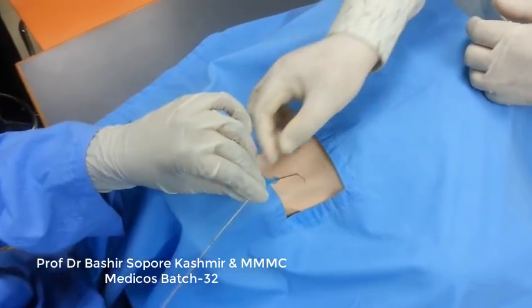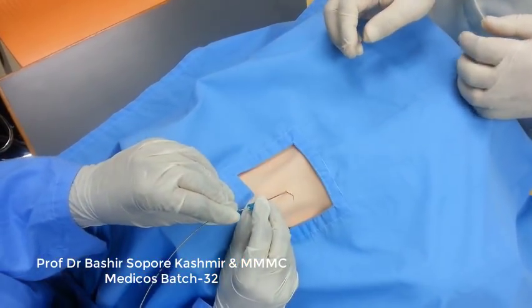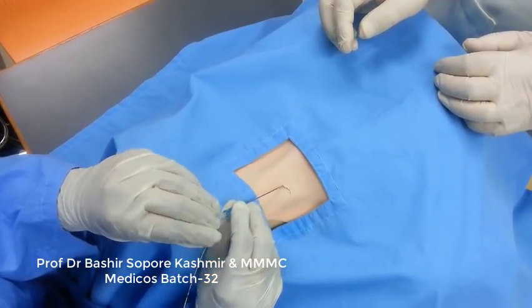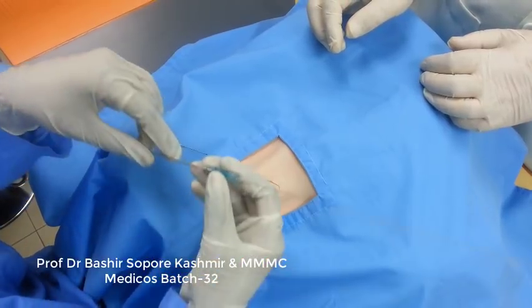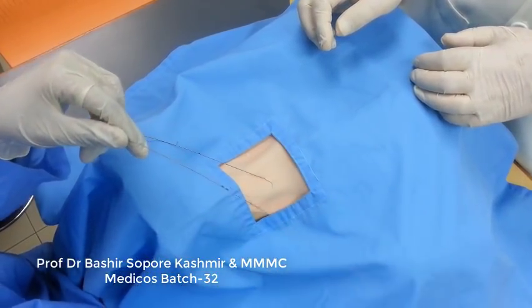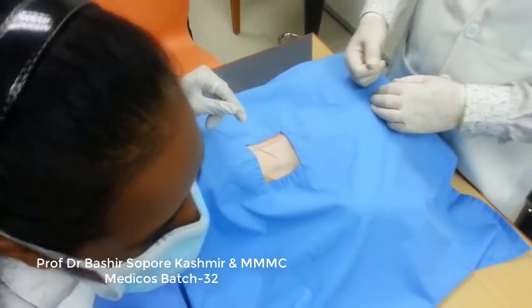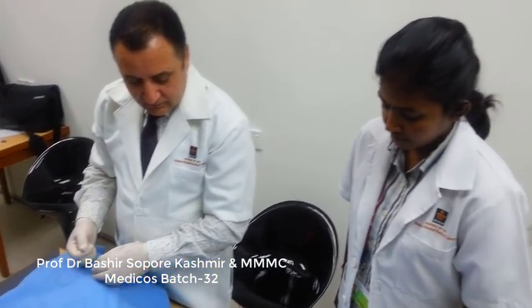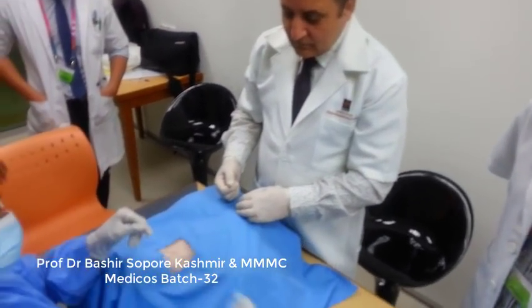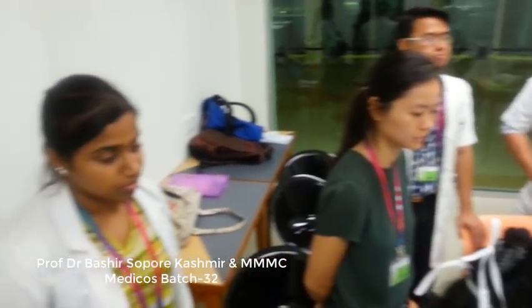So after this, we remove the needle. The introducer needle is removed. And after the guide wire, we give a nick.